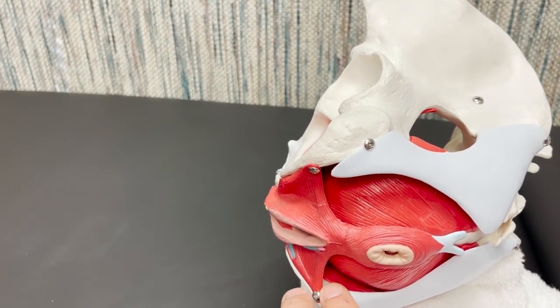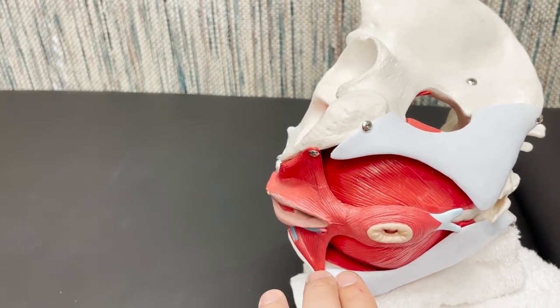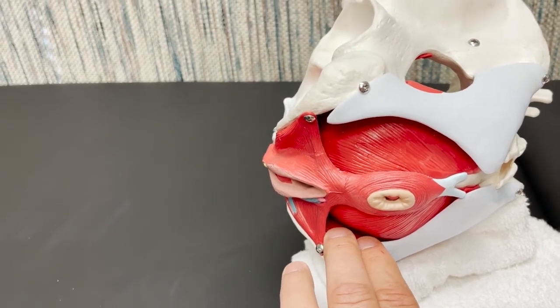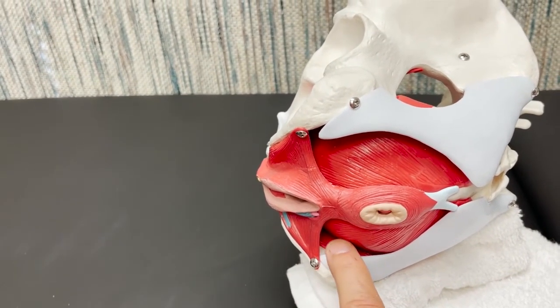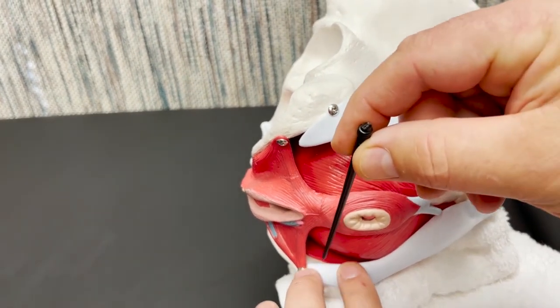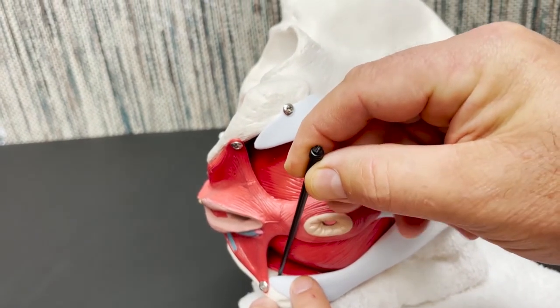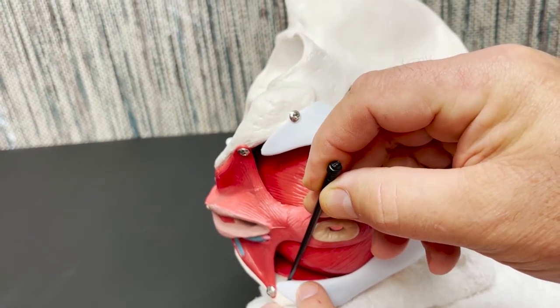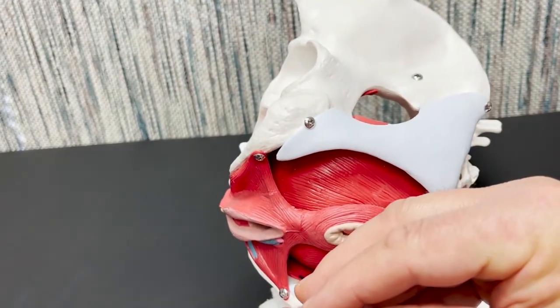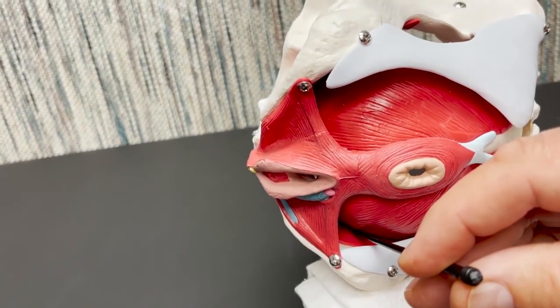We may need to push that tissue in a little bit so we can gain purchase on the medial aspect of the ischial tuberosity. Then we come in with our needle, needle down onto the medial aspect of the ischial tuberosity, and once we know our location, we change to a 45 degree angle to land into the obturator internus itself.